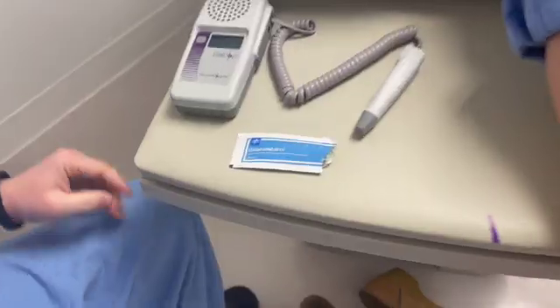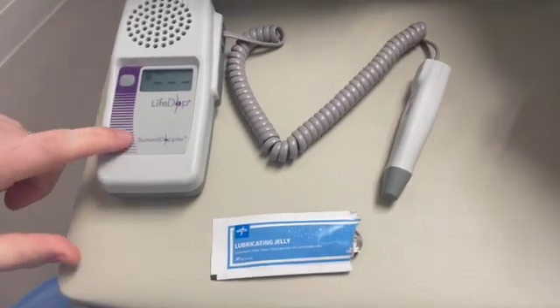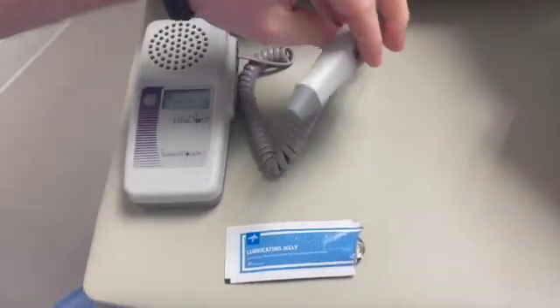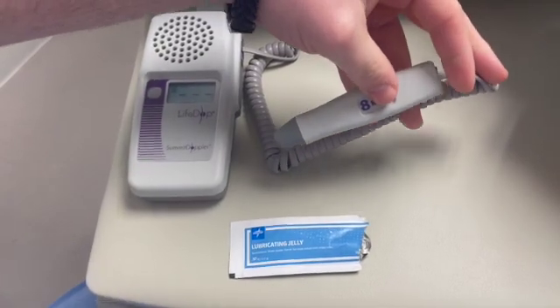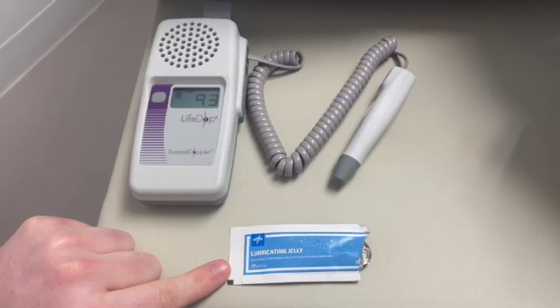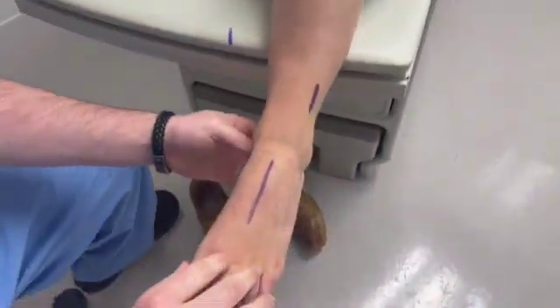We're going to show you how to do a doppler exam of the foot and ankle. Here's our setup: we have our doppler with the volume on the side, and there's the probe we're going to use to get our signal. You also have some lubricant jelly, which is the barrier between the wand and the skin.